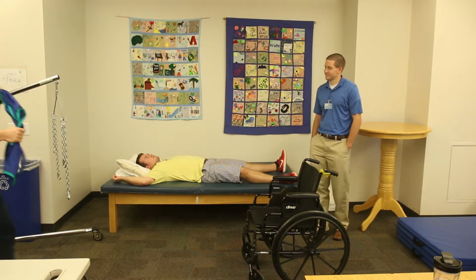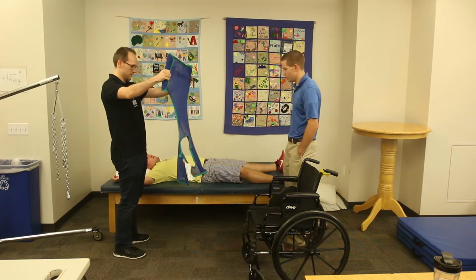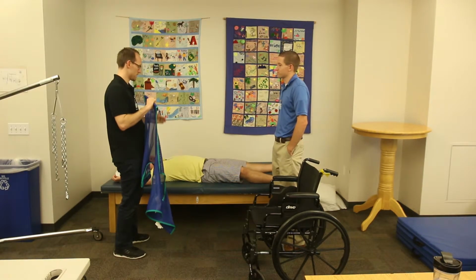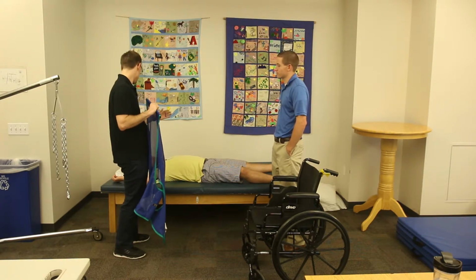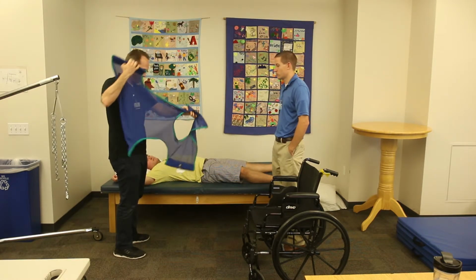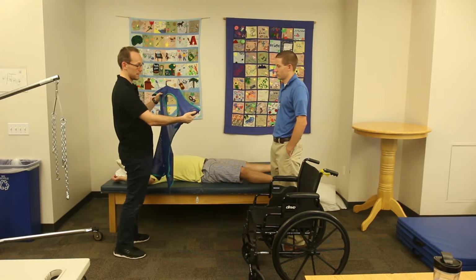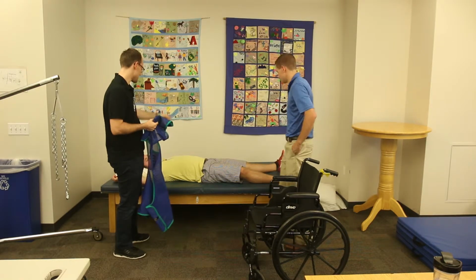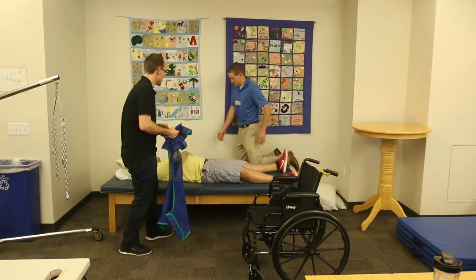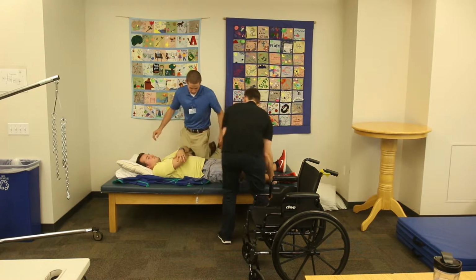All right, so I'm gonna explain to Dylan how we're gonna put this net on you. So we're gonna roll him onto his side, and then we're gonna tuck it into the side. We might have to roll back and forth. This is gonna go under his bottom, this hole. And then we want this tag to be underneath. So Dylan, can you come to this other side? We're gonna help roll Richard to his side, then I'll place this net under him.